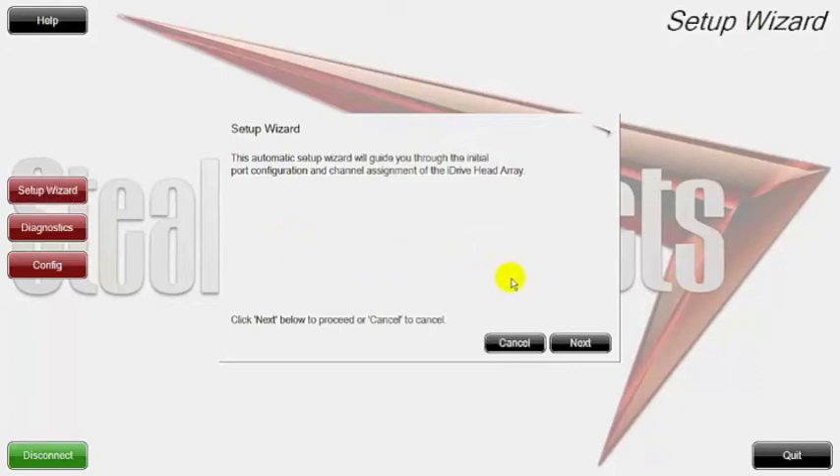The setup wizard was created to simplify the process of setting up your interface. Instead of wondering where connectors are connected, our interface allows you to port select and custom configure where your sensors or switches are plugged in. We thought it would be nice to create a setup wizard so that without having to pay attention to where you plug in underneath, you just go into the setup wizard and create whatever direction you want.